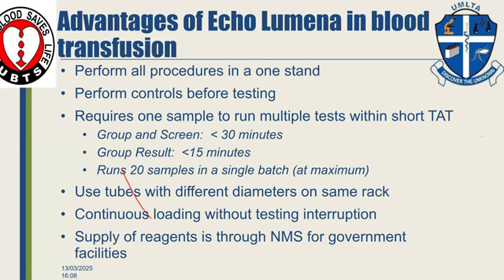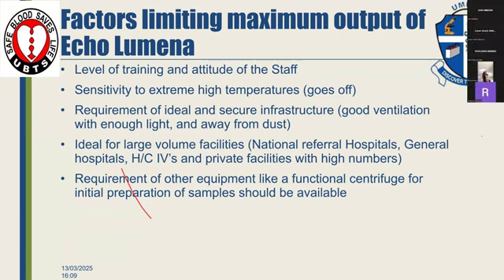Now, all those good things, what could limit the output? Here I was referring to why we have low performance of the tests using this machine. One, you have to operate this machine when you have had training. Of course, it is a short training when they are installing, but majorly it depends on the attitude of the personnel working on the machine. We are very rigid about using the old methods, including me in the hospital, but even doctors will come and say, can you use that shortest method of ours, meaning the tile method? It is upon us to educate them that, please, this is not a safe method.